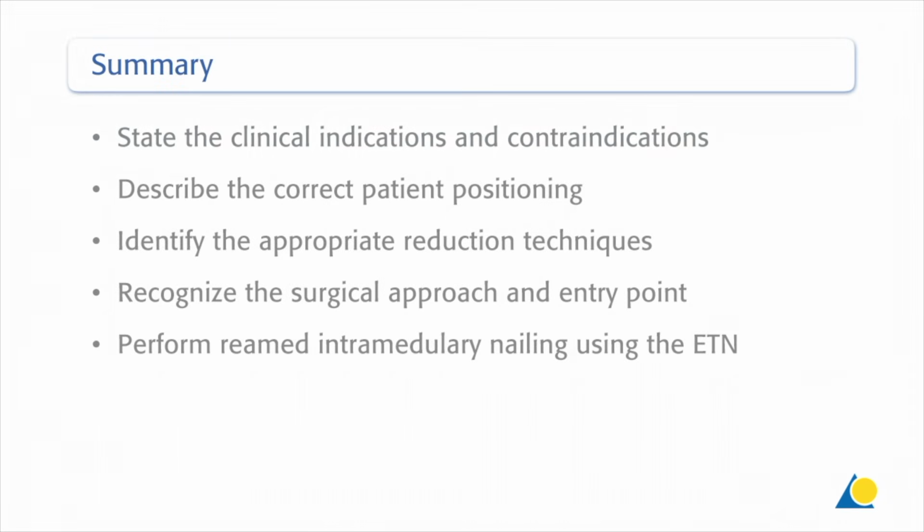You should now be able to state the clinical indications and contraindications, describe the correct patient positioning, identify the appropriate reduction techniques, recognize the surgical approach and entry point, and perform reamed intramedullary nailing using the ETN.